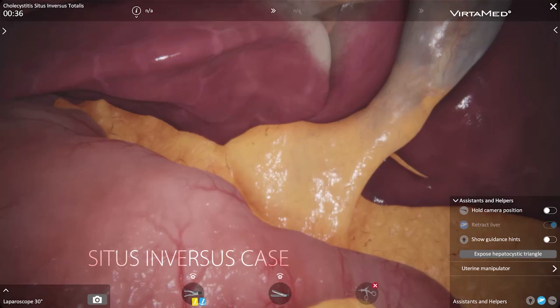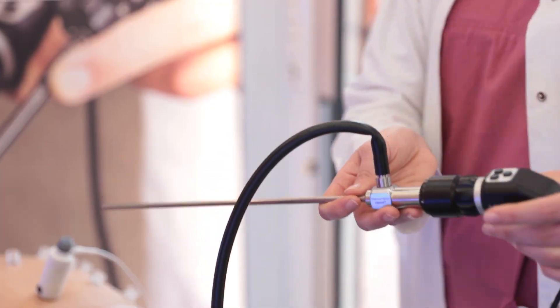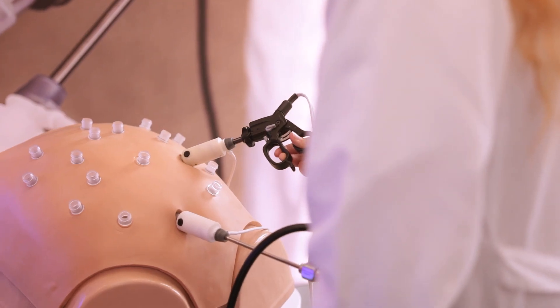With Laparus, you make sure to practice the crucial preparation steps of the procedure first. Then, proceed to train surgical skills in true-life simulation sequences.